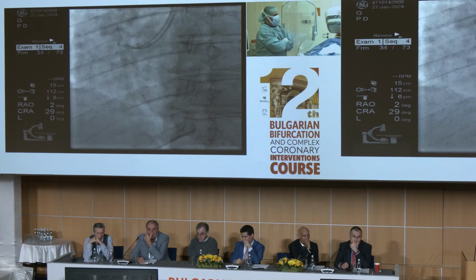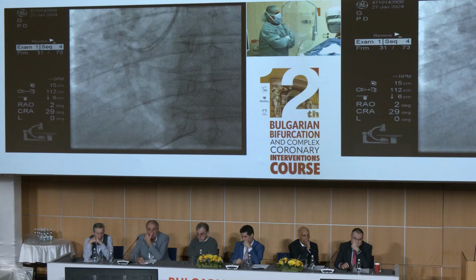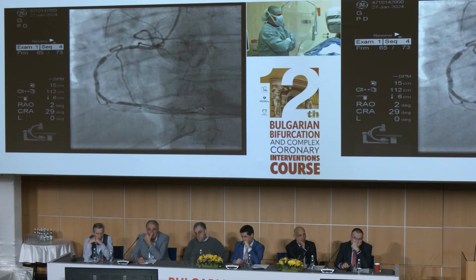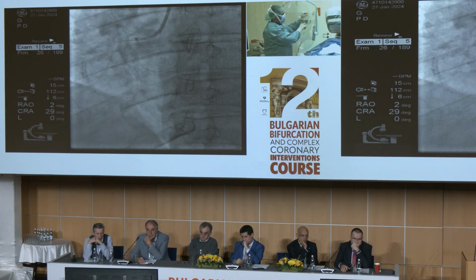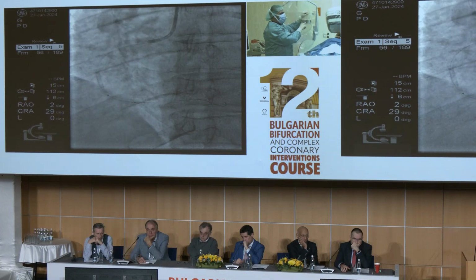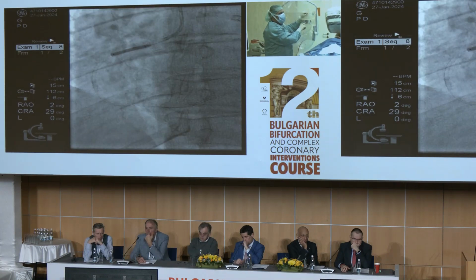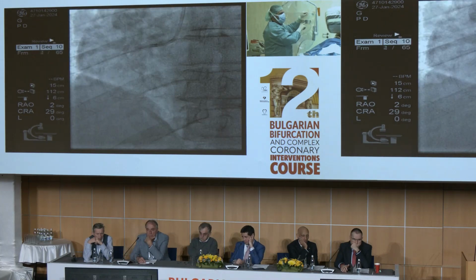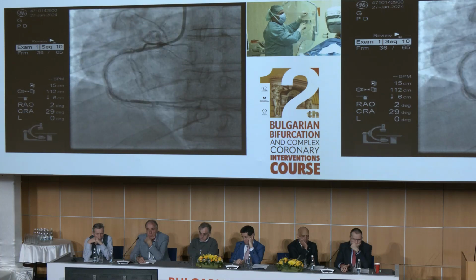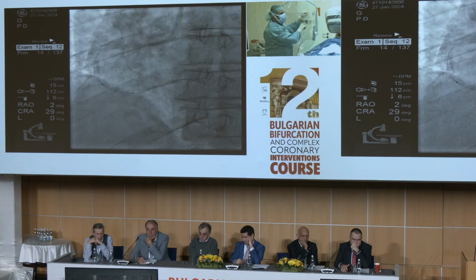The plan was to go very quick and to cover all the region with a new stent with a different drug. I was so fast that probably this is all the predilation with a 2.5 high atmosphere, and again with a 2.5 higher atmosphere than before.